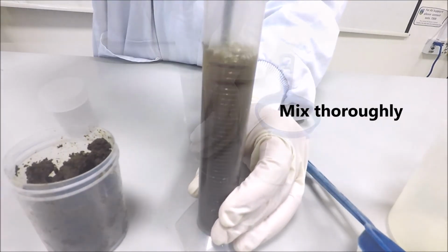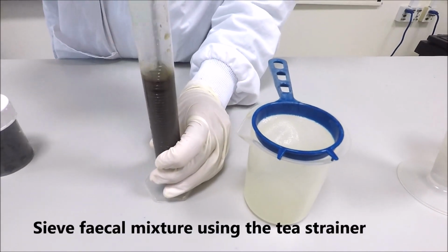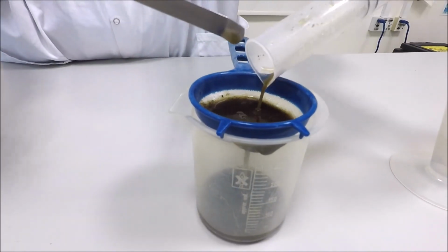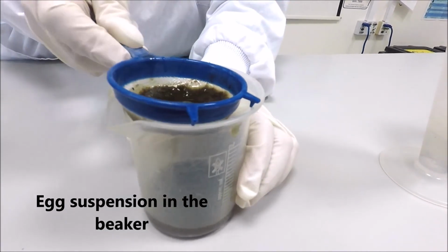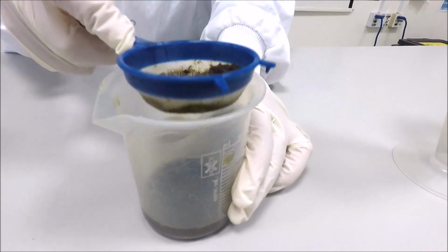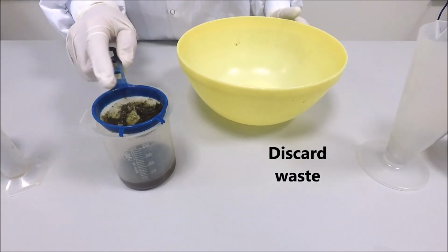Mix your sample thoroughly and, taking your tea strainer, sieve your fecal mixture into the beaker below. Your eggs will now be suspended at the bottom of the beaker. Tap to ensure all eggs pass through and discard your waste.